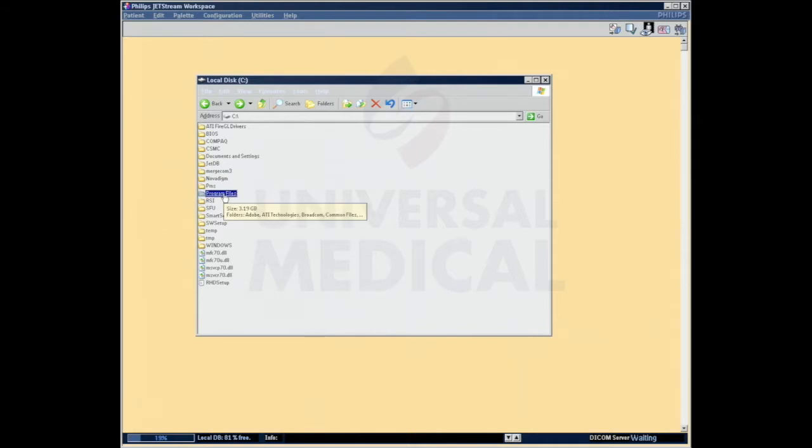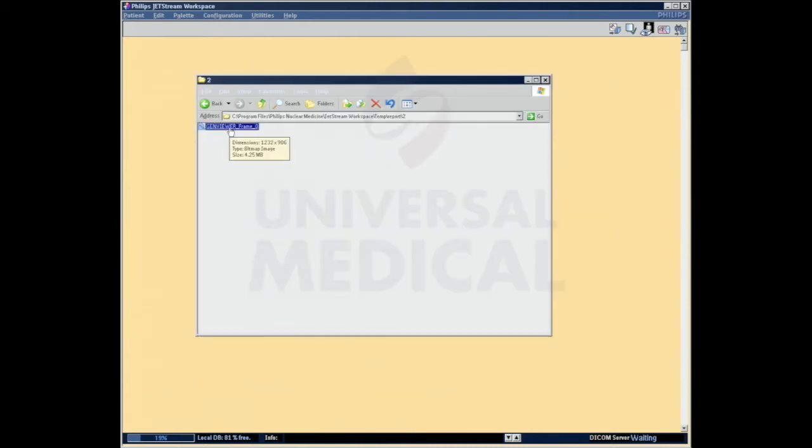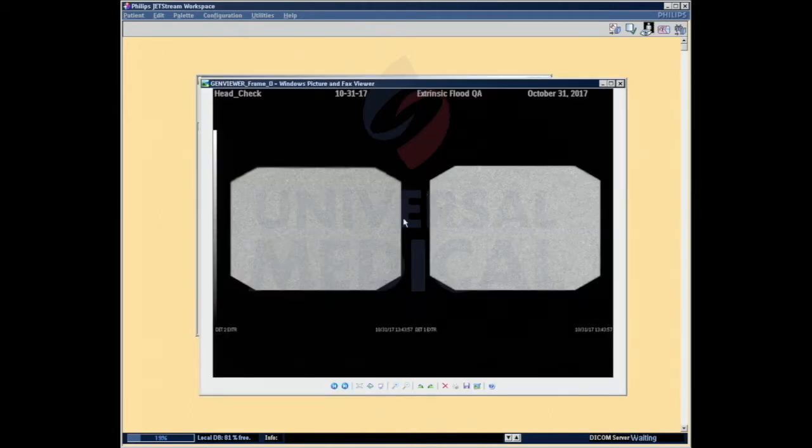If we navigate to the program files, Philips Nuclear Medicine, JetStream WorkSpace, Temp, Report. We navigate to this directory structure, we're going to see a whole bunch of numbers in here. These numbers are actually referring to studies that have had reports generated on them. So if I was to look at the first one, I'm going to see that it's actually a picture. If I hover over the file, you're going to see it's actually a bitmap picture. So it's a Windows bitmap image. It's taking up 4.5 meg. These would have been used in reports when reports are generated.